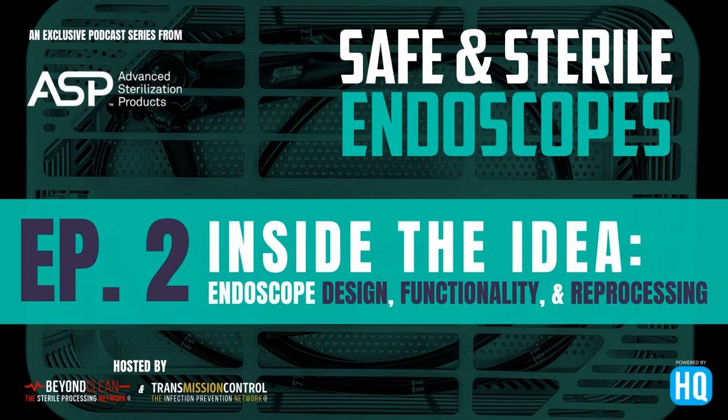So as we continue to move from AERs, ECRs, and now into, okay, now we want a sterile scope. What does that look like? Can we even sterilize something that's 6 to 9 feet long? Can we guarantee that those internal lumens are cleaned properly? Because if you look at that change in reprocessing and that standard, are we going to high level disinfect and then send it for sterilization? Or are we going to manually clean and then prep it for sterilization so that it's not going through the HLD part of the process? And that's where we'll rely on the IFUs from the devices as they come to market to see what that is going to look like.